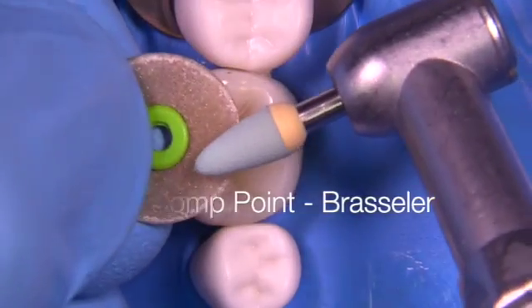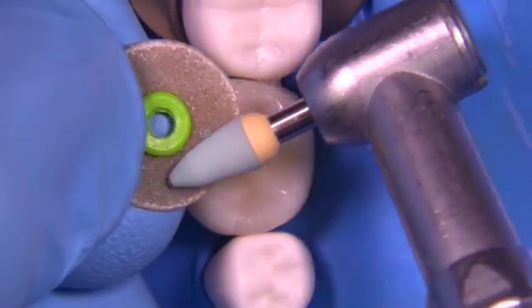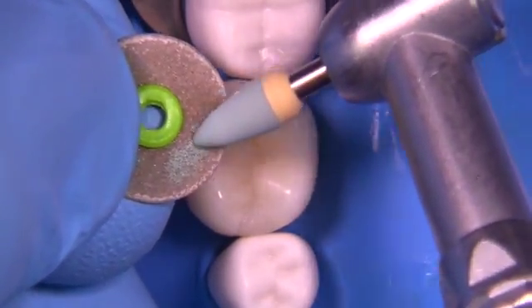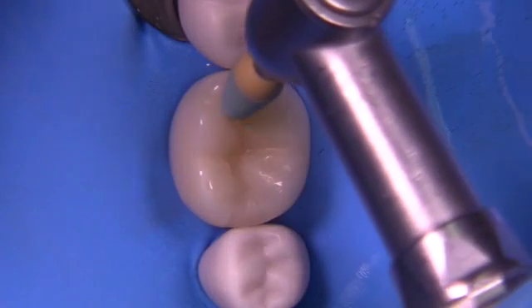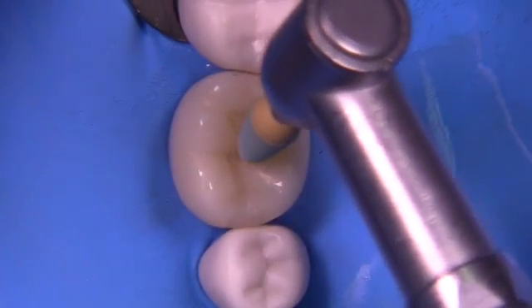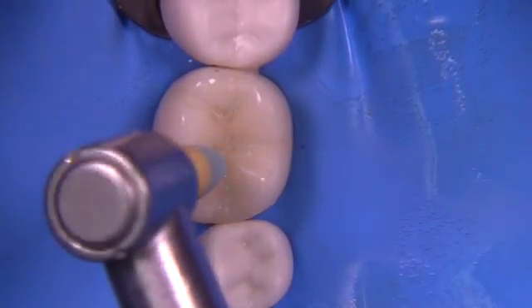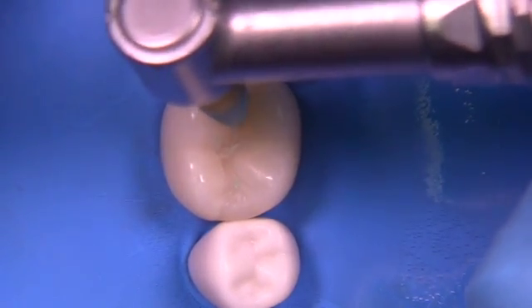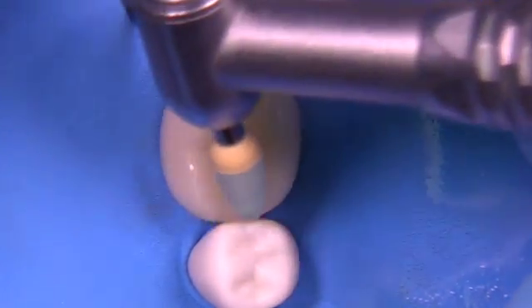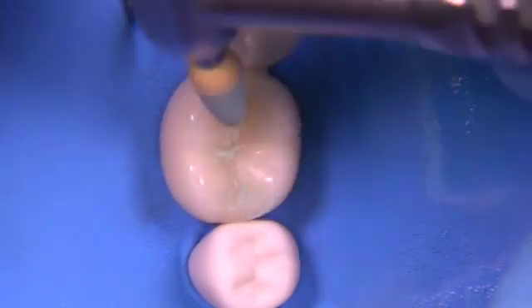Let's use a Diacomp point by Brasseler. Run this point — which is dull in this case — up against a disk like an OptiDisc coarse to create a new sharp point. These are expensive so it's nice to be able to get the most out of them. We're now going to use this in the groove areas. The primary purpose of points is to go after groove areas and not the convex surfaces. This is all being done at slow speed; if you're using electric, I think 10,000 to 20,000 RPM is appropriate.